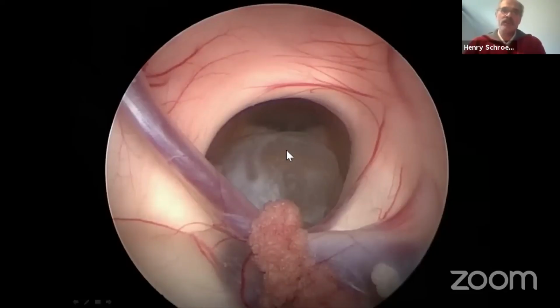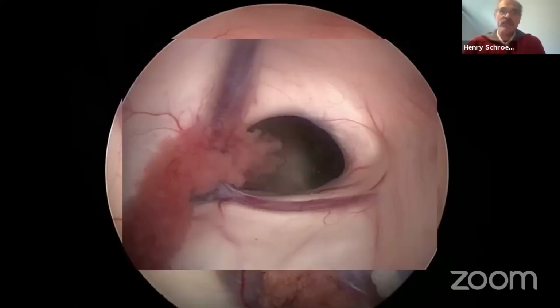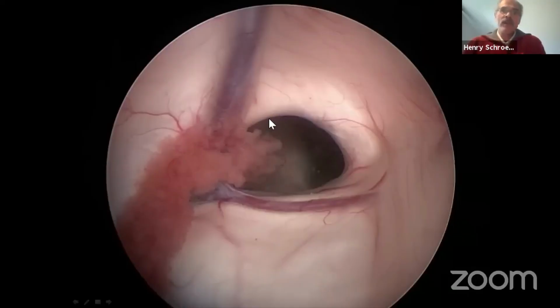We removed this colloid cyst, and the ventricles became smaller, although there's not an absolute occlusion. This was very surprising to me because I thought there would be no change. But obviously, the CSF circulation and pulsation was already disturbed by the small cyst. You see there's a small foramen of Monro, and also the venous anatomy is very variable.